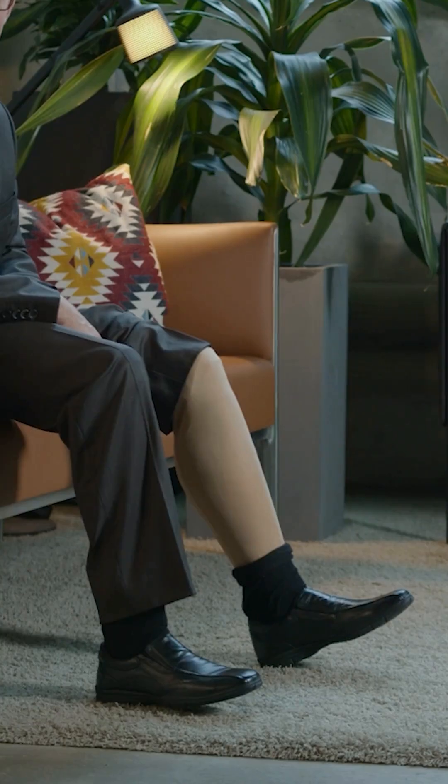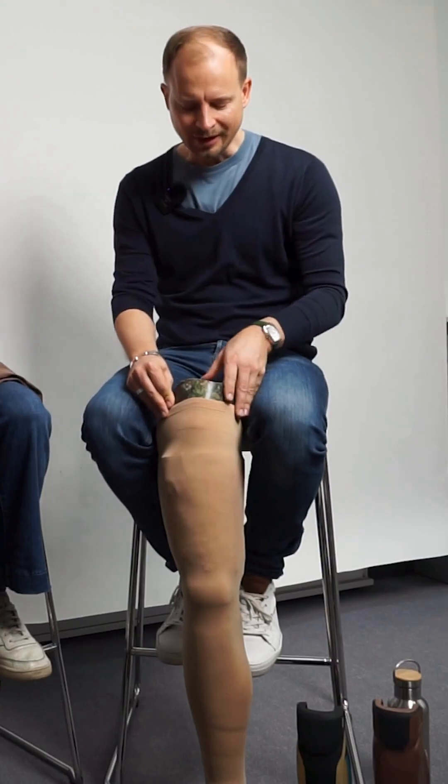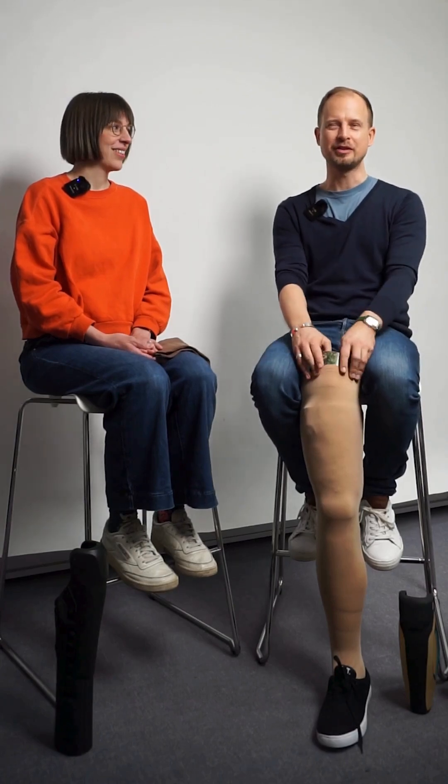I'm Sonja. I'm Walter. We developed all the cover solutions for Genium X4. The most significant advantage is that the user can put all the devices easily on and off as they want to use it in their daily life. Every cover solution we provide has some hidden interesting features.